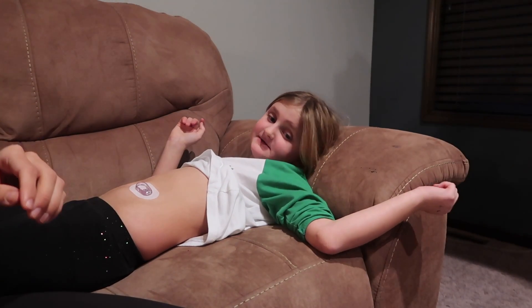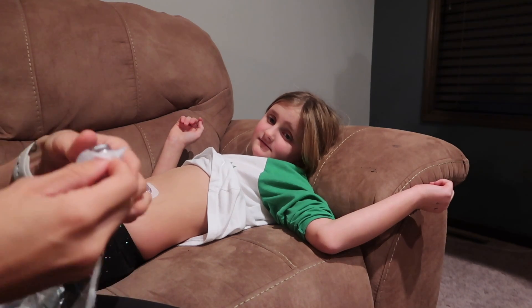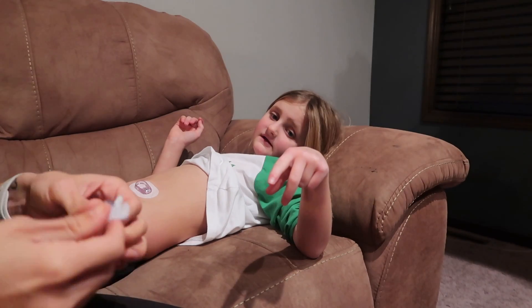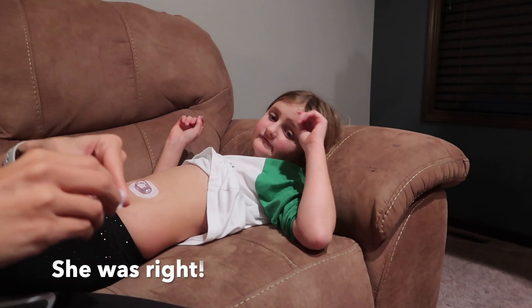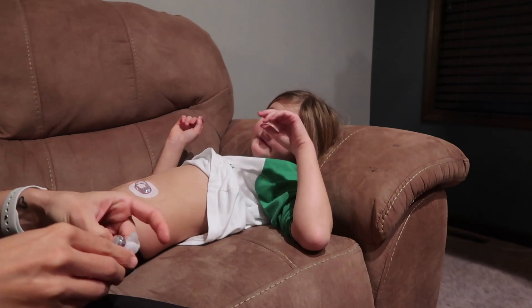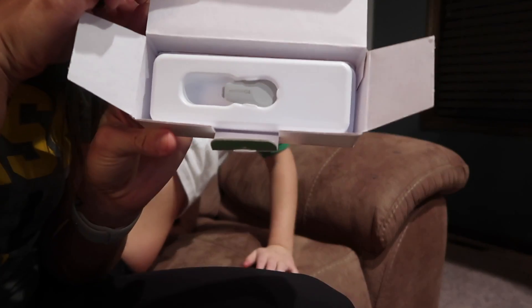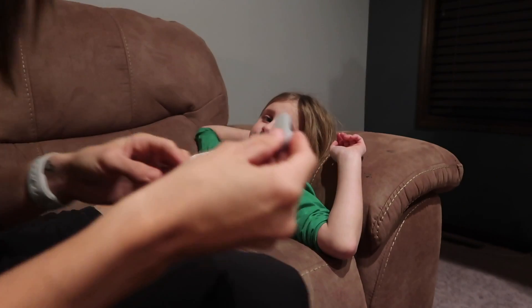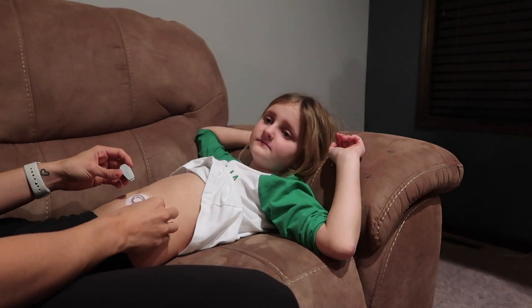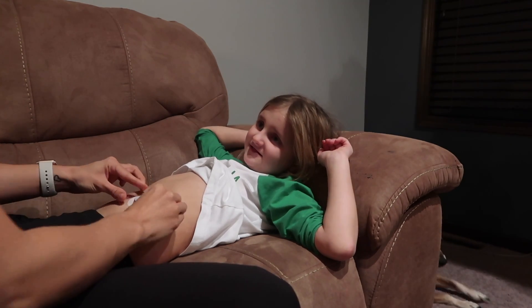I guess this is actually going to be a really speedy round. Oh, I didn't take the sensor off this — I need that. We need a new sensor in two weeks because it failed. The sensor failed in two weeks. We are using a new transmitter, which is this gray thing — the other one is going out, so we need a new one. We're going to click this in. Serial number.